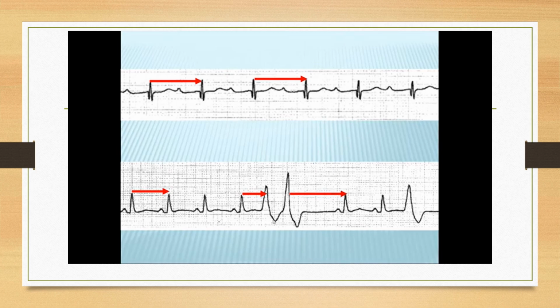If you count 5 QRS complexes, then it will be 4 RR intervals, not 5 RR intervals. So you must open your eyes and brain and count 5 RR intervals instead of counting 5 QRS complexes. It is the most common mistake by students on the exam.